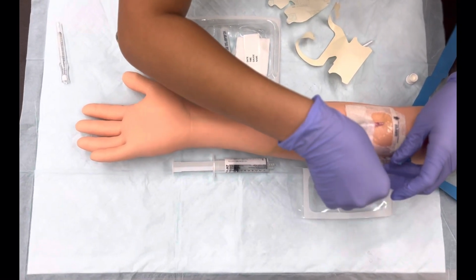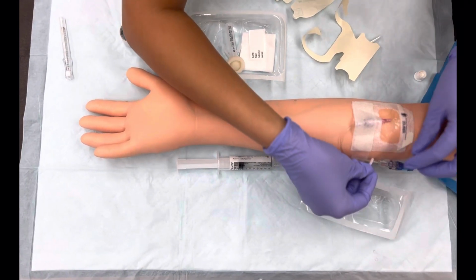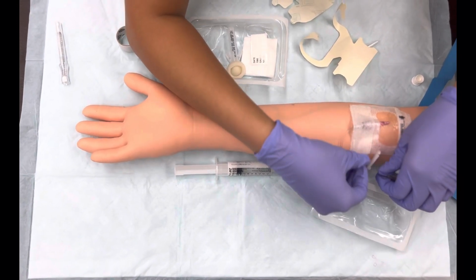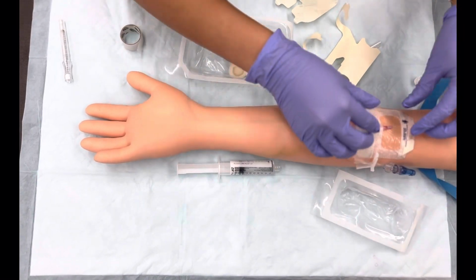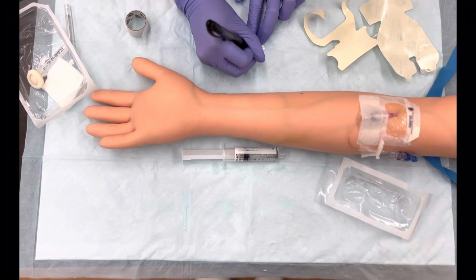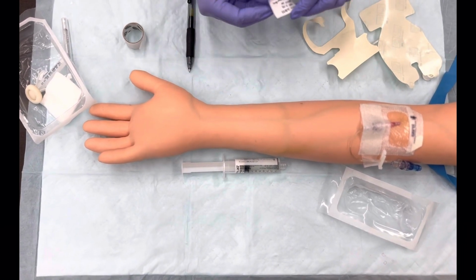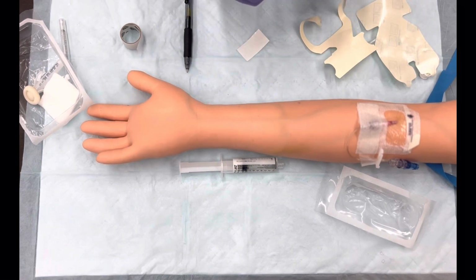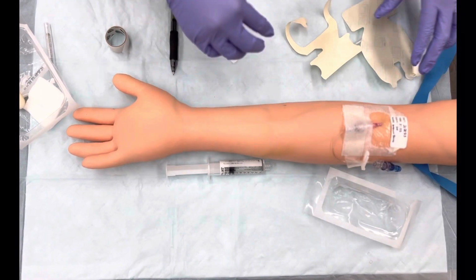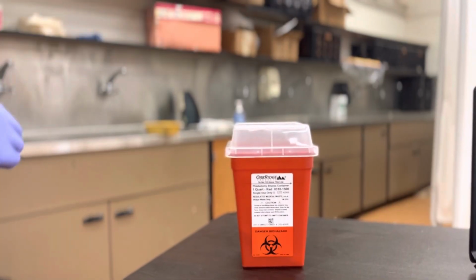Tape the IV extension beside the Tegaderm. Label the dressing with the date, time, and RN initials. When done, discard your supplies and dispose of sharps in the appropriate container.